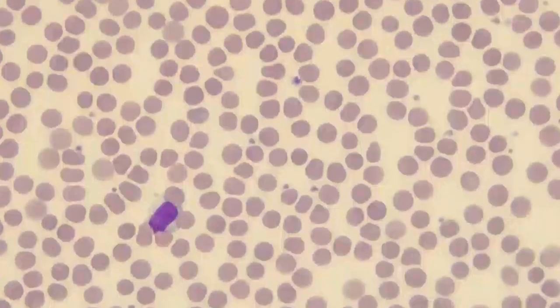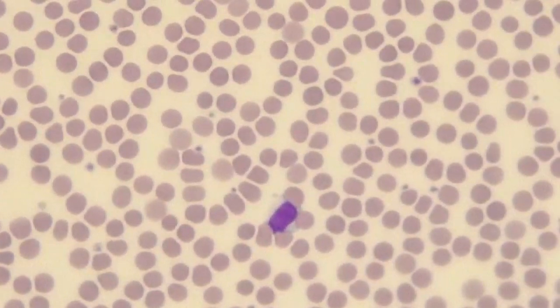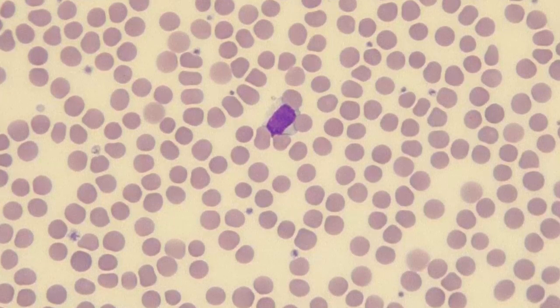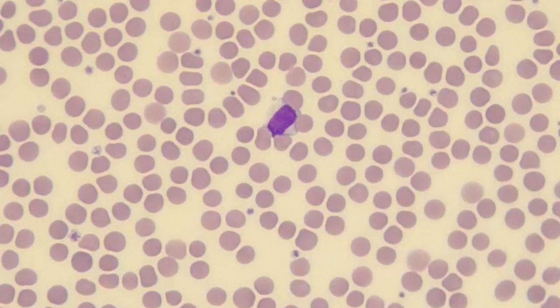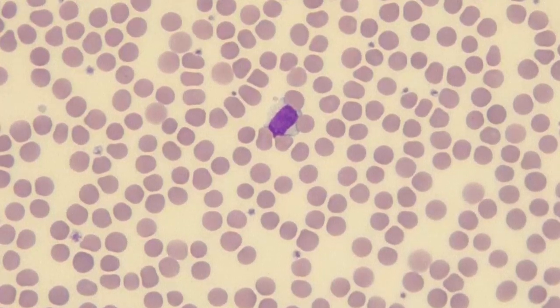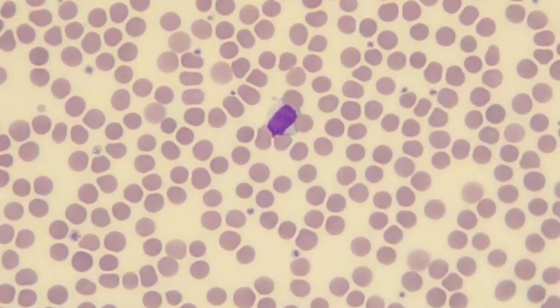Okay, now here is a large lymphocyte in contrast to the small one that we just looked at. First of all, it's bigger than that other lymphocyte. What differentiates it also is the fact that the nucleus tends to be rectangular. And there's going to be a bit more cytoplasm. The cytoplasm is going to be a lighter blue color than the dark blue of the smaller one, and maybe the chromatin is not going to be quite as clumped as in the small lymphocyte.